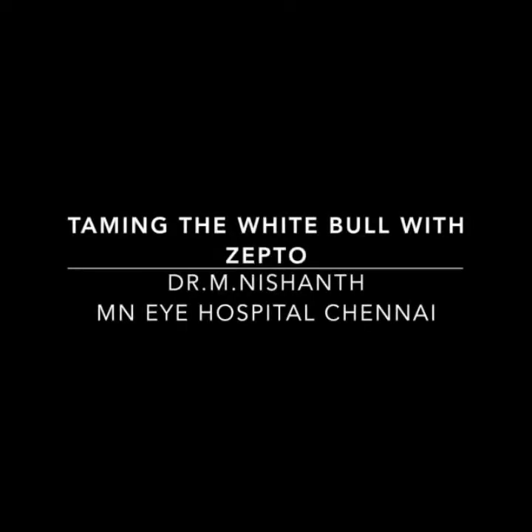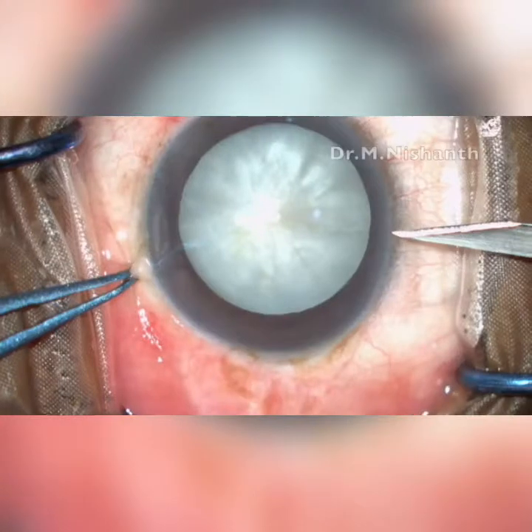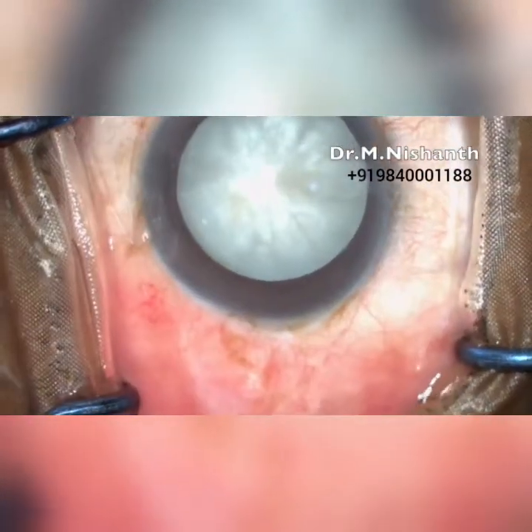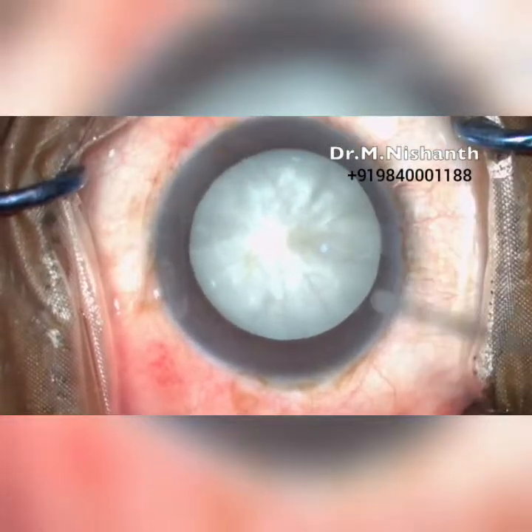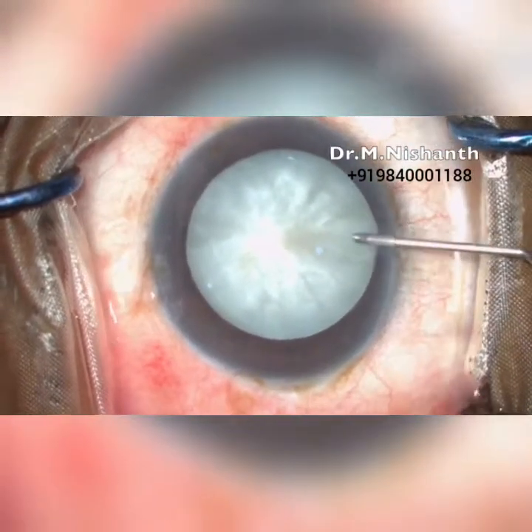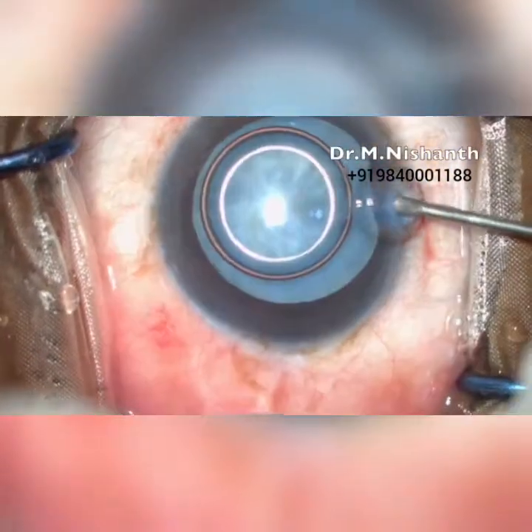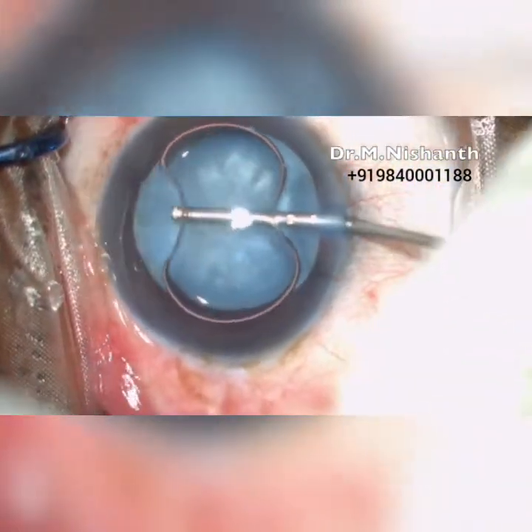Continuous curvilinear capsulorexis is the most challenging step in phacoemulsification, especially in mature intumescent cataract. This is the latest and most advanced technique for doing a capsulorexis with precision and accuracy for every single case.